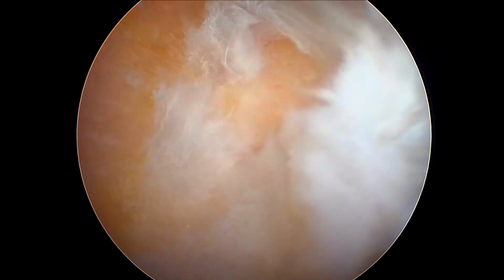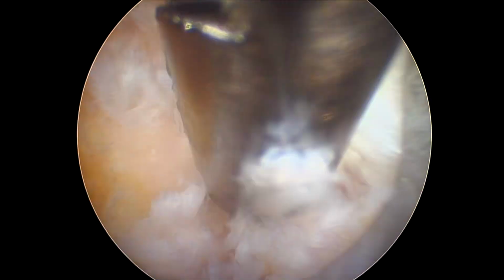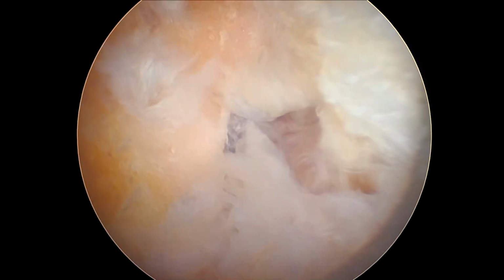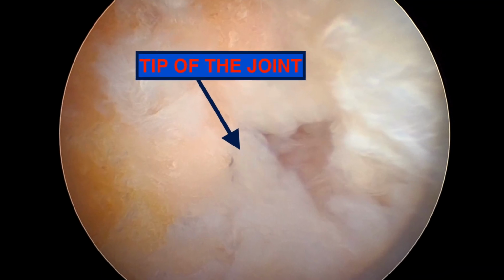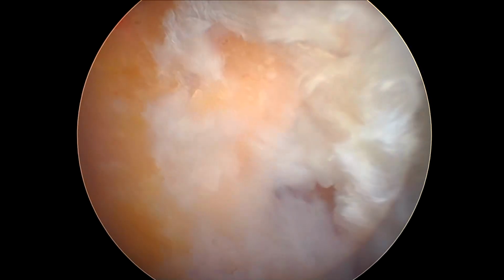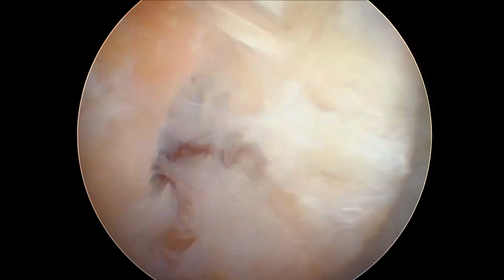So we are already seeing the joint and the tip of the joint, so we can clean the joint using graspers. That's the tip of the joint after removal of the osteophyte. So we go further, we clean the joint, we can do the surgery.